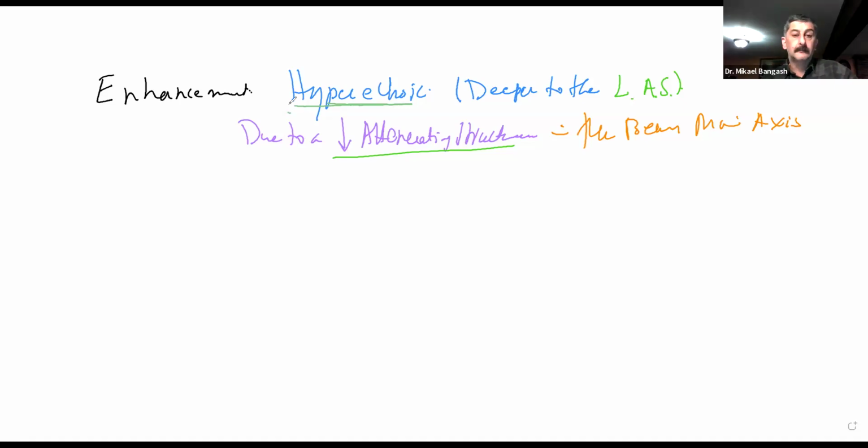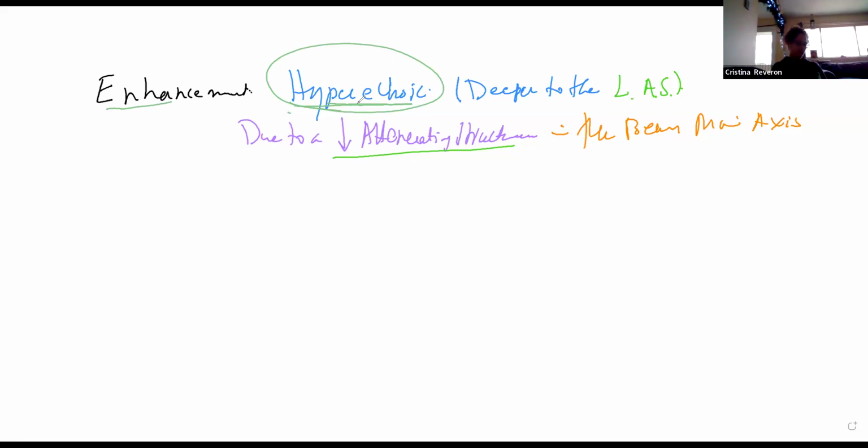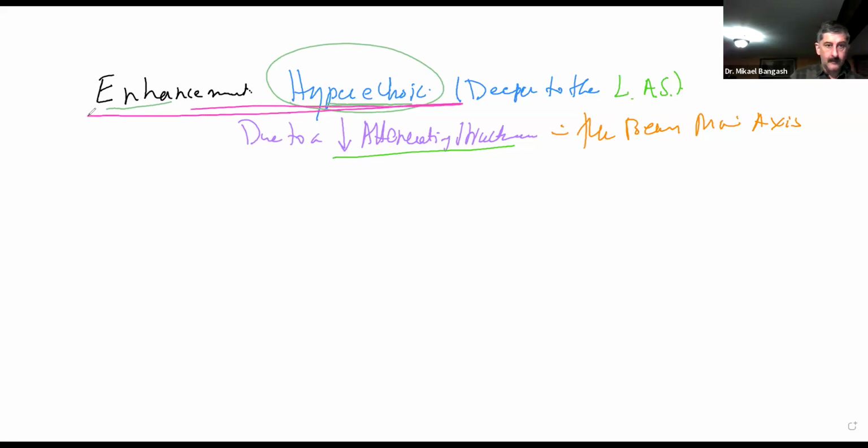Did that make sense? That's why we call it enhancement, and they're going to become hyperechoic. Did you guys get that? Any questions? So one thing to remember is that enhancement is going to be hyperechoic.